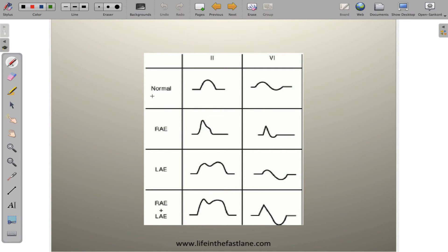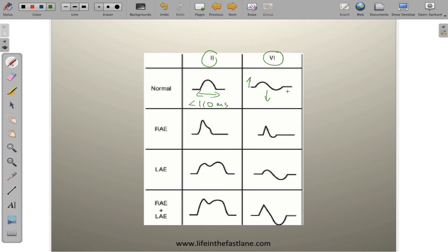Let's talk through this chart quickly. Normal P-wave: leads 2 and V1 are the best leads to view atrial activity. A normal P-wave is a nice upright, rounded P-wave less than 110 milliseconds in duration, and less than 1 millimeter tall or 1 millimeter deep in lead V1 — a biphasic wave resulting from right then left atrial depolarization. In right atrial enlargement, the right atrium fires first, giving you a prominent right-sided peak.